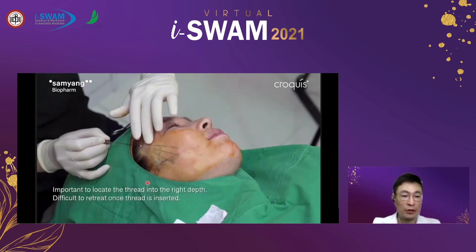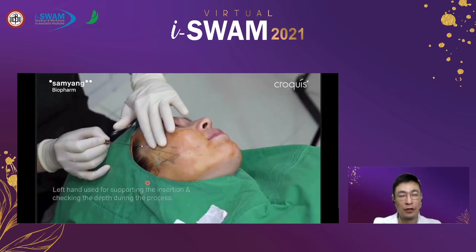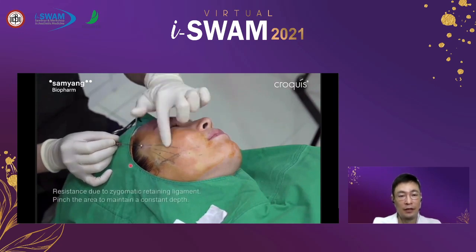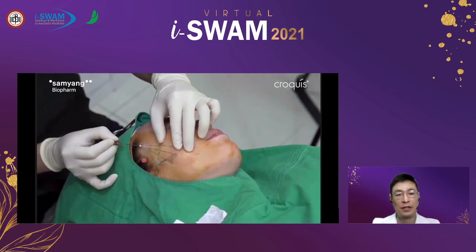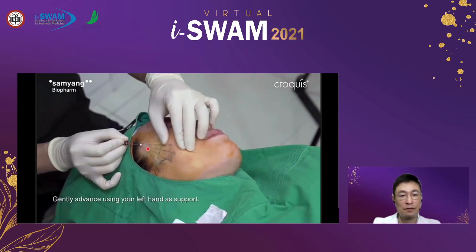It's very important. Then penetrate the dermis with the thread, and you should advance almost at 0 degrees, that means very horizontally and almost parallel to the skin surface.